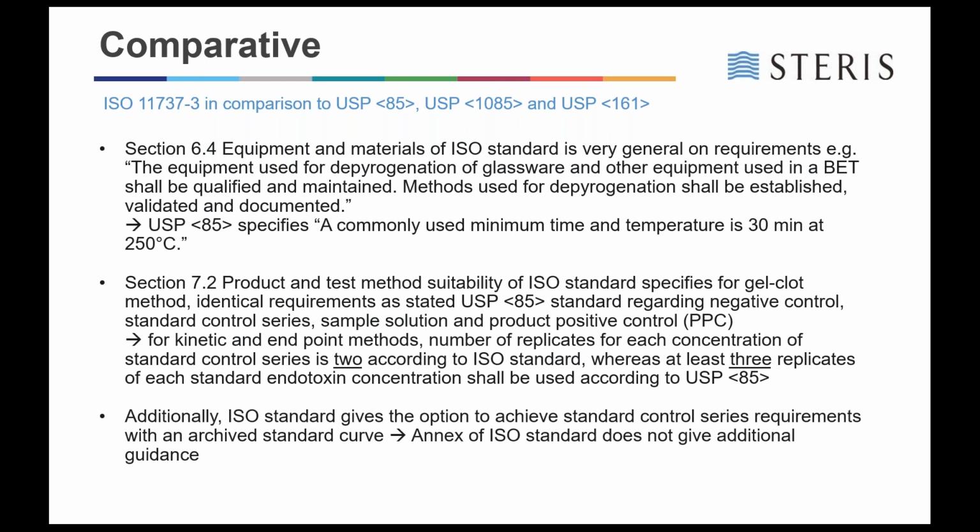Additionally, the ISO standard opens up the option to achieve this standard control series requirements with an archived standard curve. However, there is no detailed guidance given, for example, in the annex of the ISO standard regarding this new possibility.